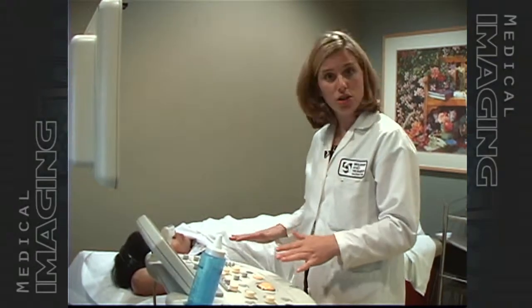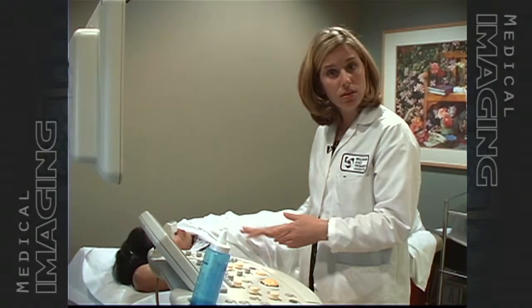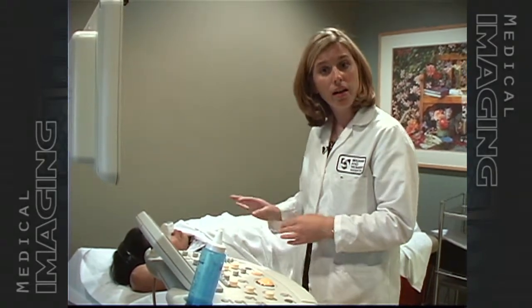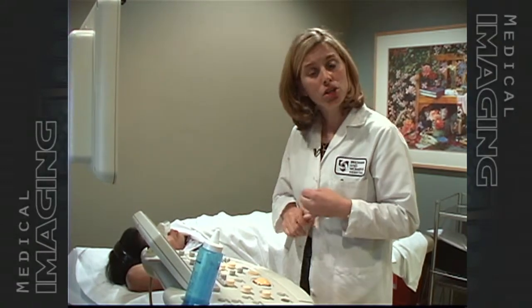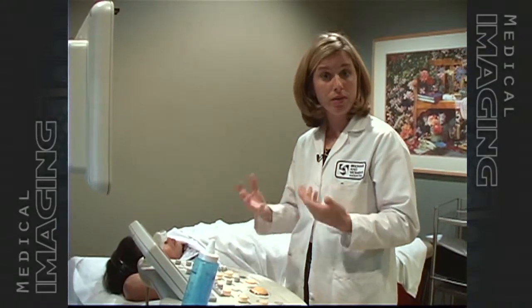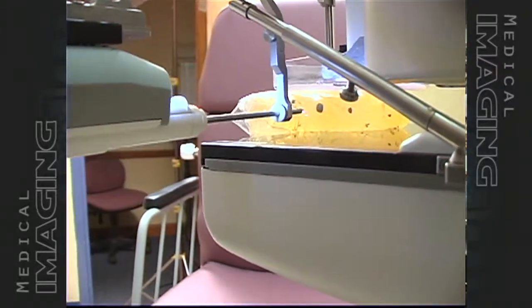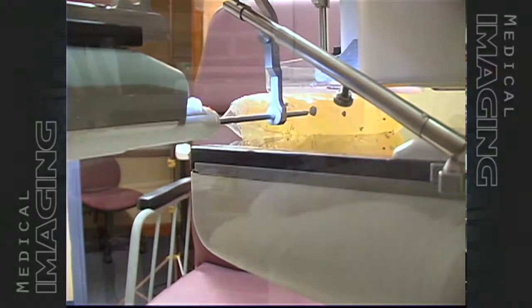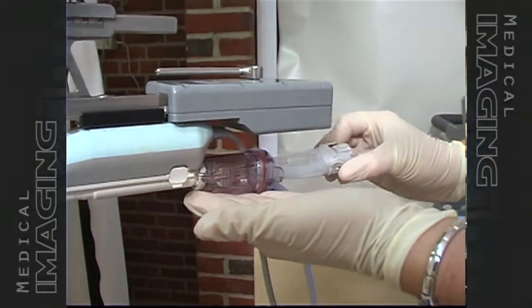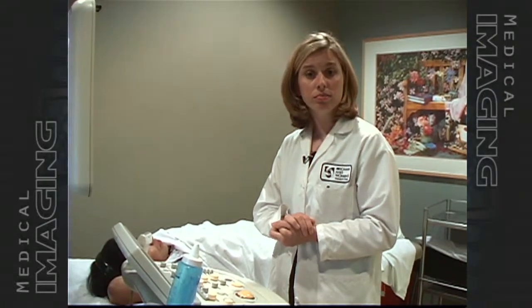We use the same procedure — the ultrasound probe to localize the area — and then we use a sterile technique. We clean the entire area, mark the area, and give the patient local numbing medication, much like patients have at the dentist before a dental procedure. Then using the ultrasound, we can visualize the needle as it goes into the lesion. We take approximately five samples of the lesion and send them to the pathologist, who can then tell us what the mass is and whether the patient needs further surgical excision or if it's a benign finding and we can simply monitor the patient.